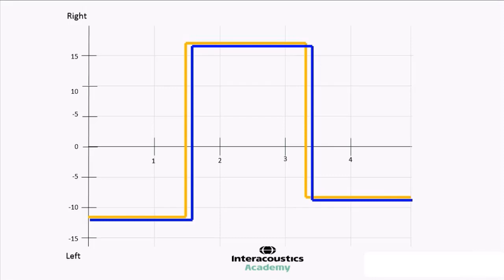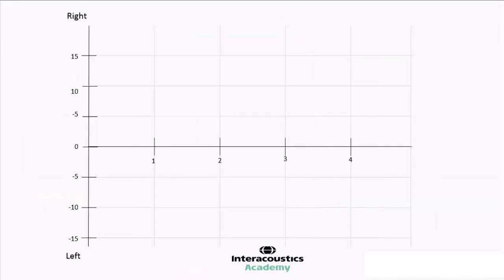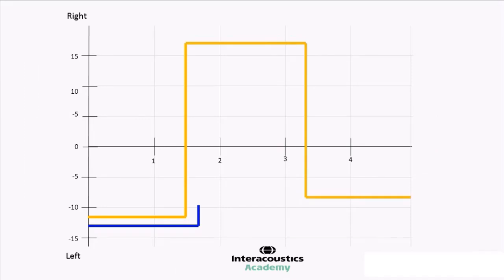Now within this test we've got some different parameters that we can look at that allow us to quantify some of the abnormalities. So I'd like you to have a little look at our first abnormality here. What we have is an eye movement, and what we're measuring is a latency of eye movement. So the time that it takes for the eye to move after the target has initiated the eye movement.